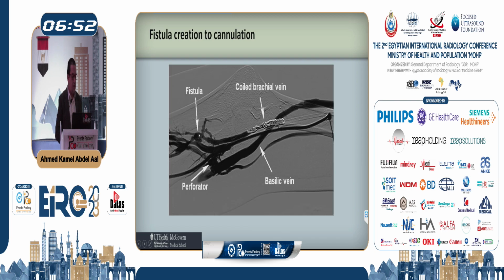When you look here, here's the fistula. We're injecting contrast from the artery. It goes through the fistula, back into the vein, which goes through the perforator and back into the basilic here. The cephalic is very, very minute, which is this one.